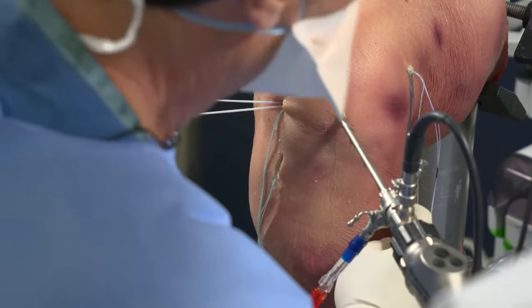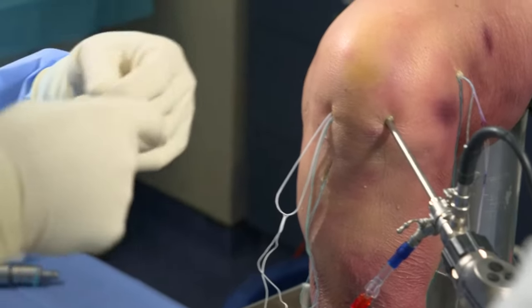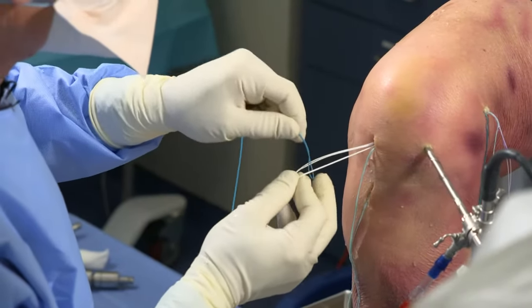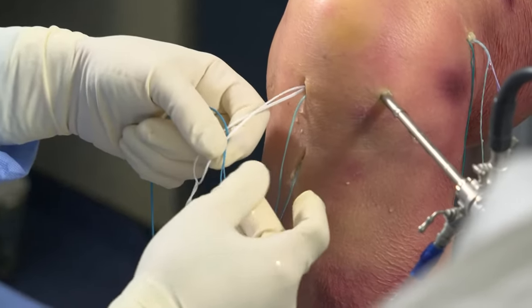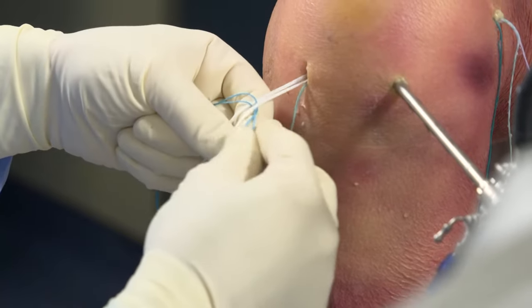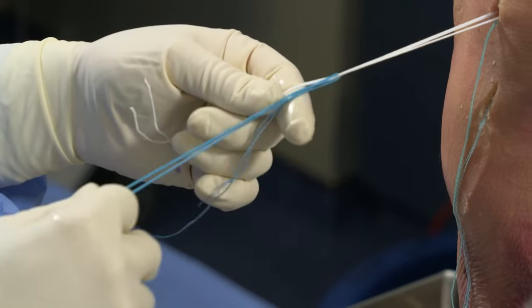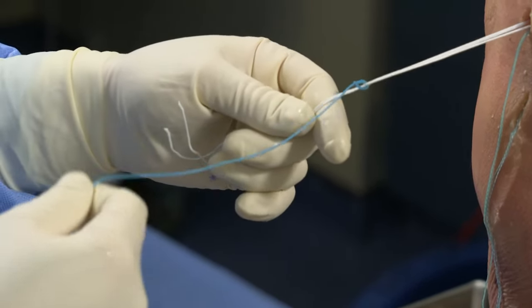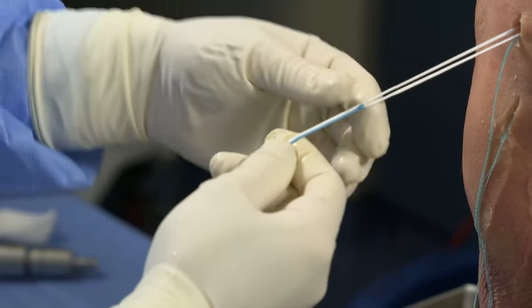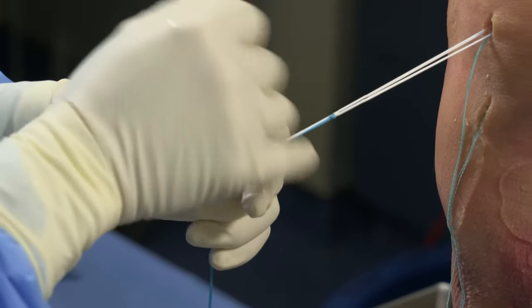I'm going to take this suture and place it through the rigid loop suture loop. I like to place a luggage tag configuration to help hold it right there. What this does is it allows me to pull the suture in through the tibial tunnel without risking shortening the suture loop until I'm ready to do so.